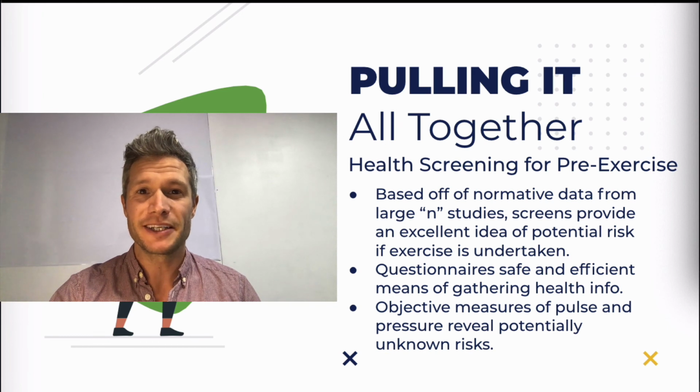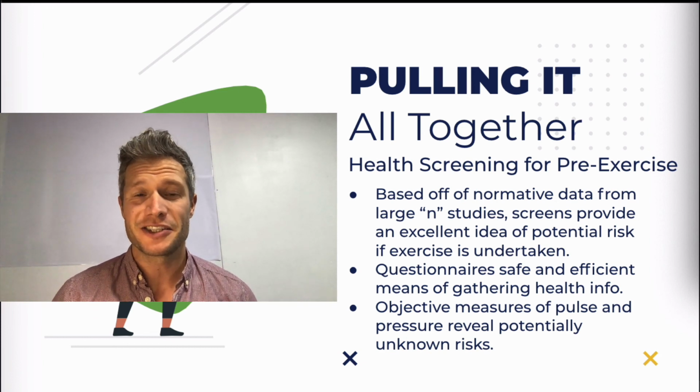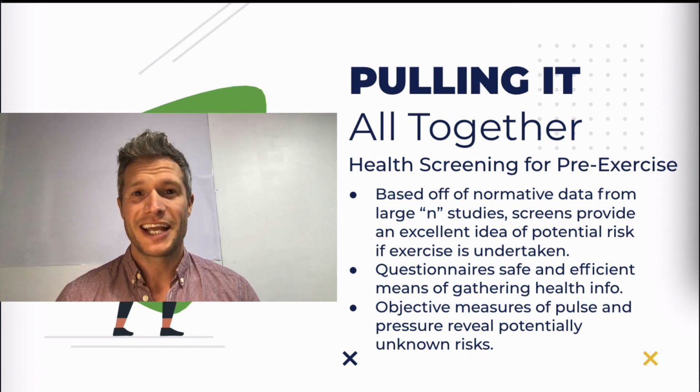Okay, well, have fun essentially practicing taking someone's blood pressure. I highly suggest you do that quite a bit before diving into submitting your lab activity of blood pressure. And similarly with the pulse rate, it's really good to just practice it, figure it out on yourself as well as anyone around that's a willing participant. Okay, have fun with that.